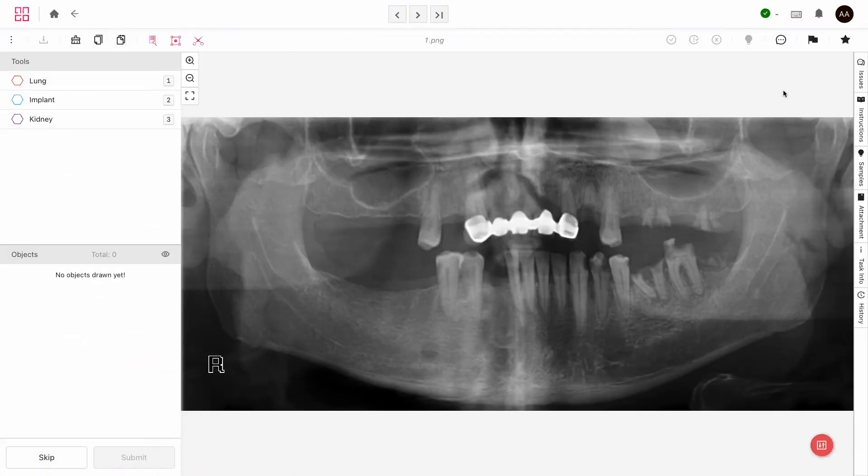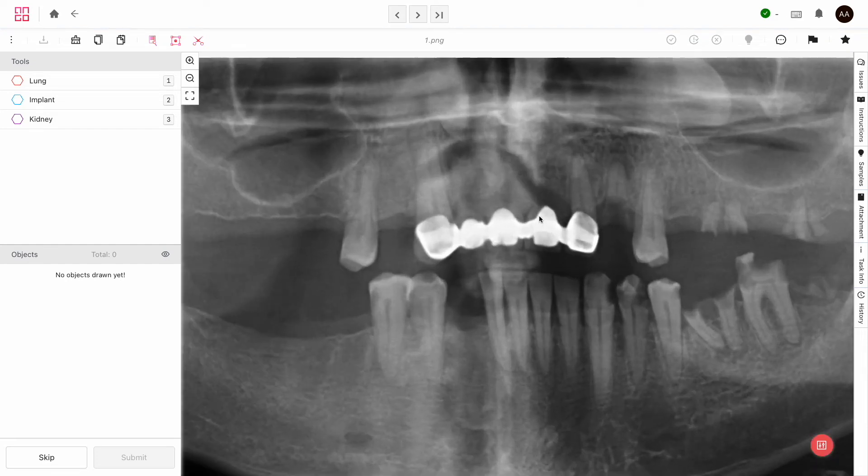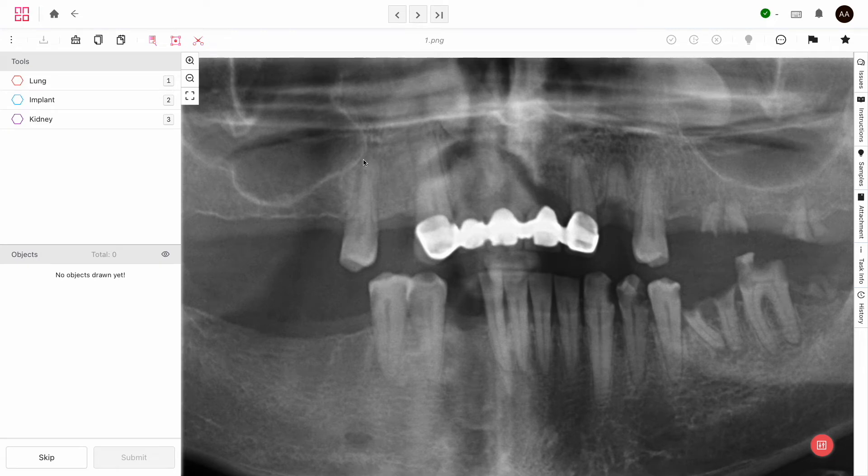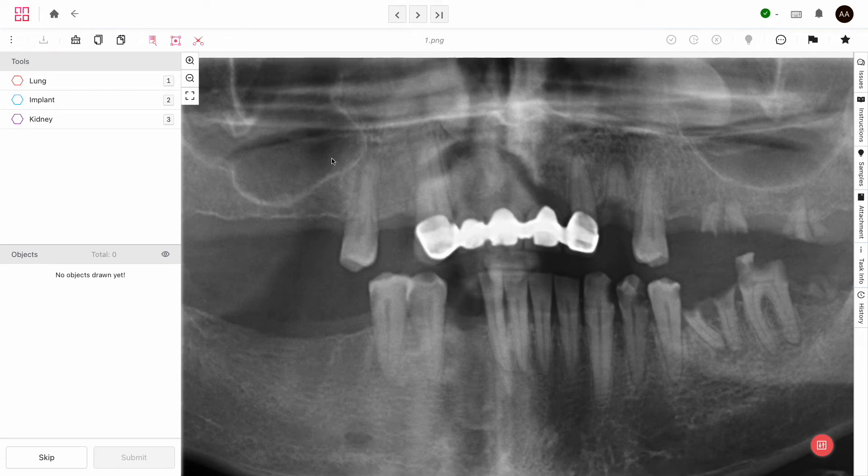You'll be shown the first unlabeled asset in the queue. Now, this is a familiar x-ray and this white section here is an implant. I could draw a label around it manually, which I'll show later, but there are faster ways.